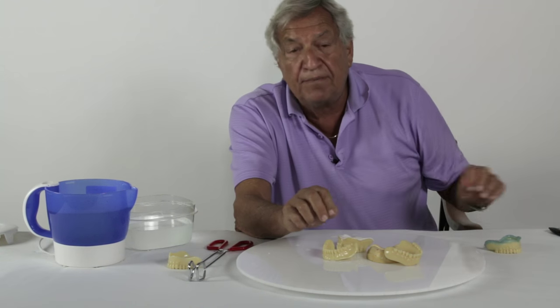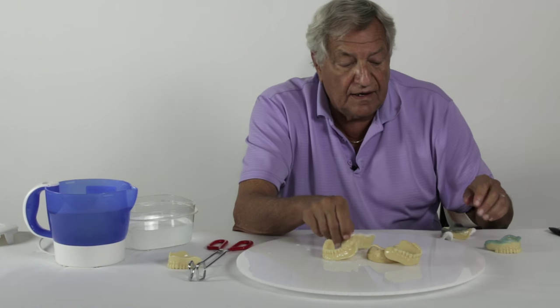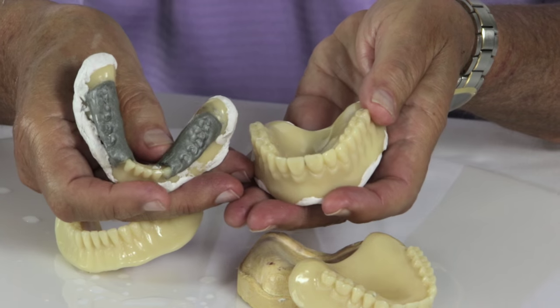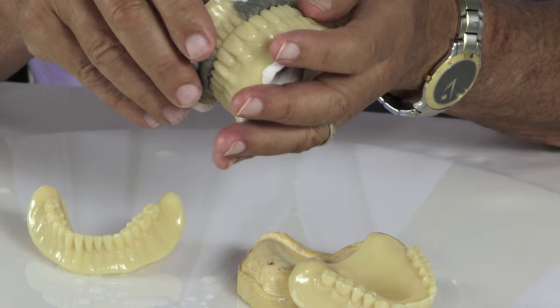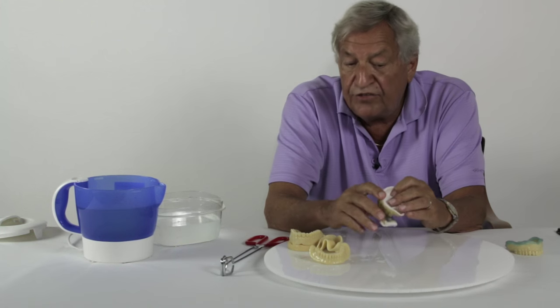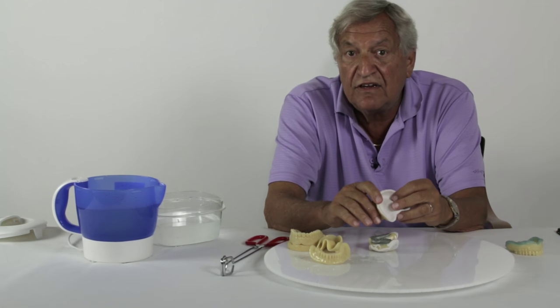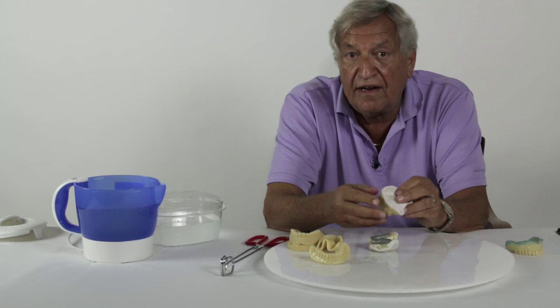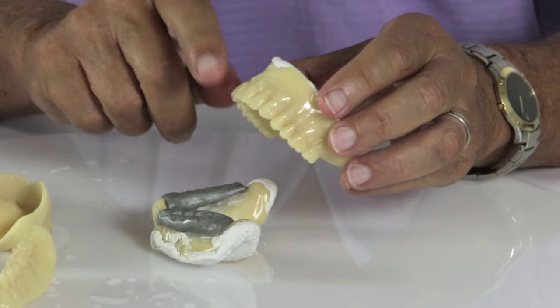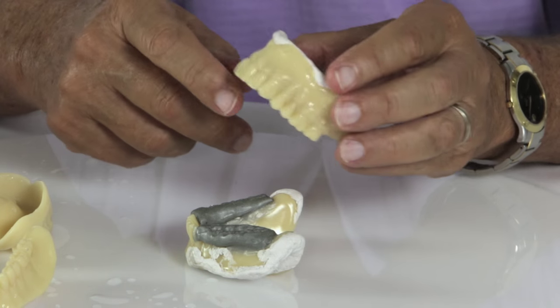Once he's done that, the last step in the procedure is to take a centric relation. This can be done with any material of choice — this happens to be with aluwax, but he can use any material. He takes his bite, then removes them from the mouth, cleans off any excess, and can use these trays and impressions as a try-in. You've done your dimensions and your records, so you can verify with the patient. If everything is acceptable, the lab can then go directly to finish.